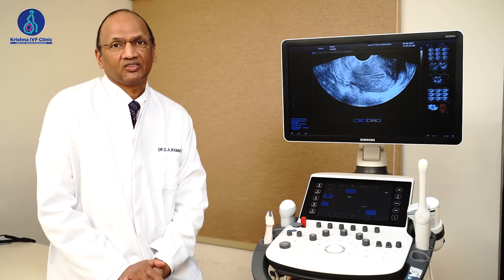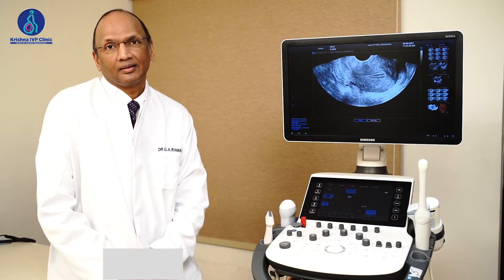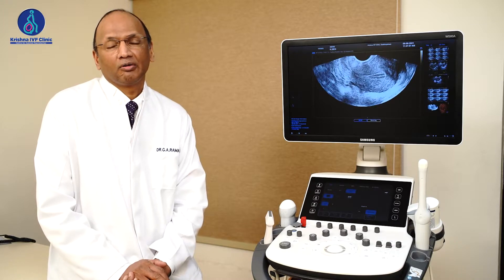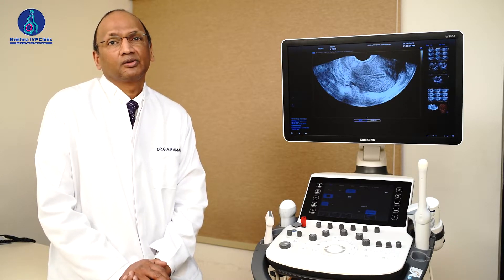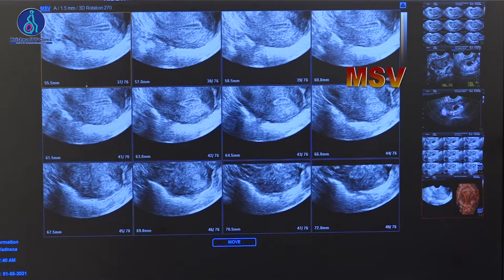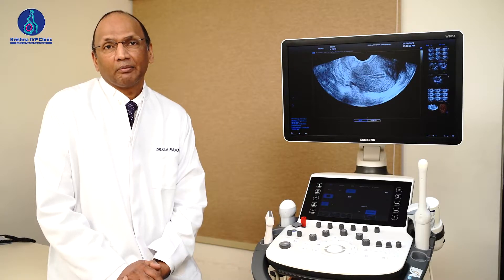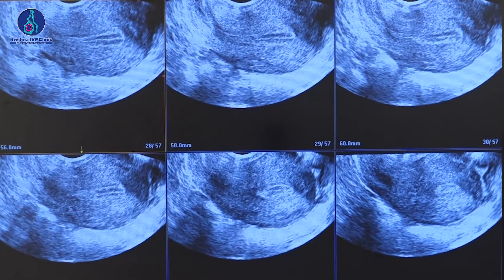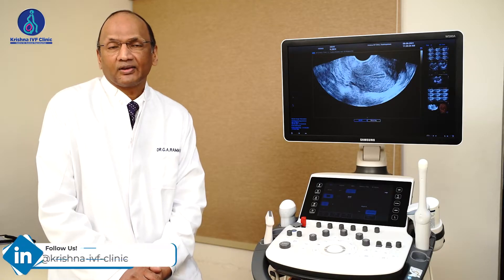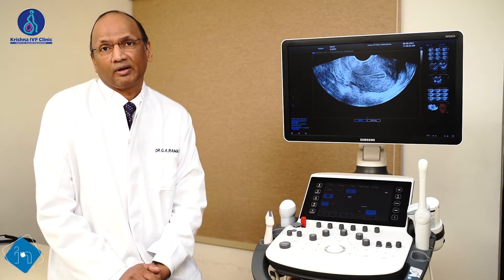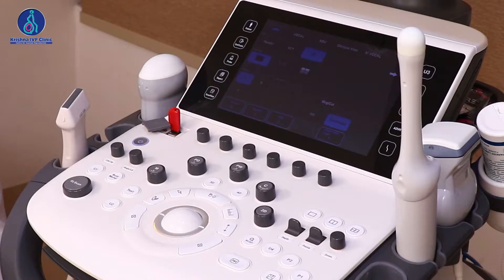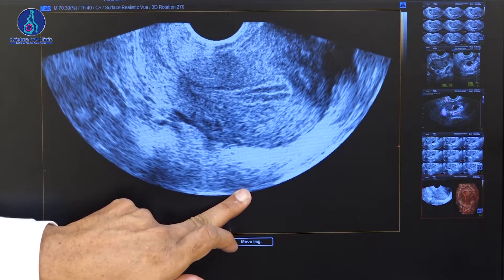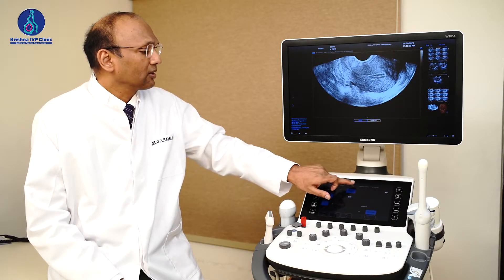We will be looking at another aspect of 3D ultrasound called MSV. After you acquire a volume of the uterus, you can slice it into multiple slices like how you slice an onion, and the diameter of the slices can be adjusted from 0.5 mm up to 10 mm. Let's see how it works when we use the MSV function on the Samsung WS-80 machine. Here is the 2D image of the acquired image, and now I am going to the function called MSV.